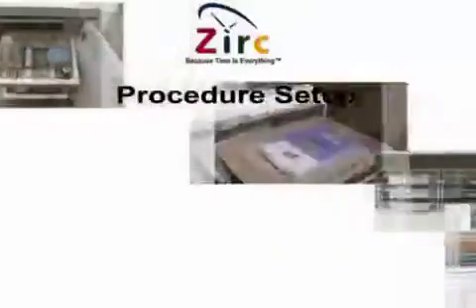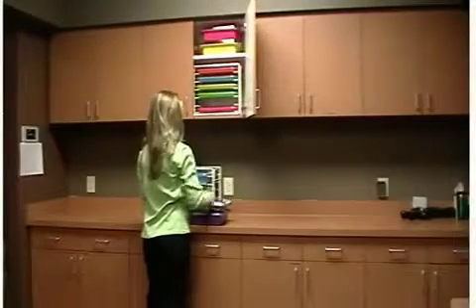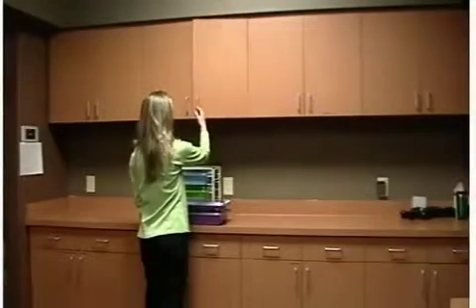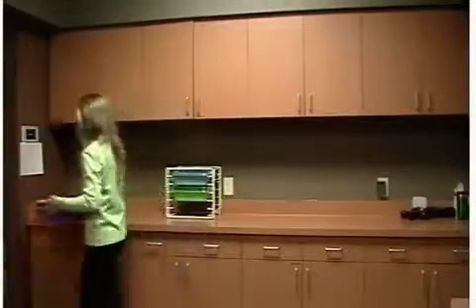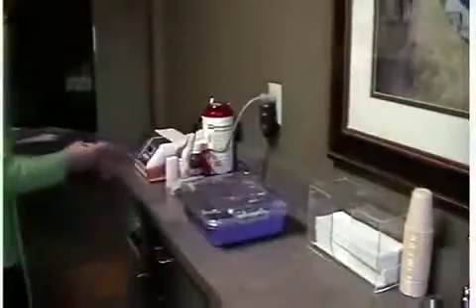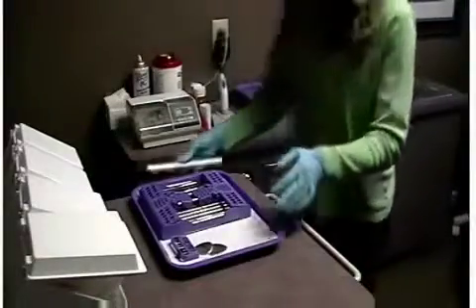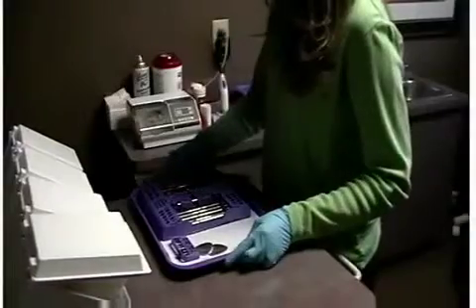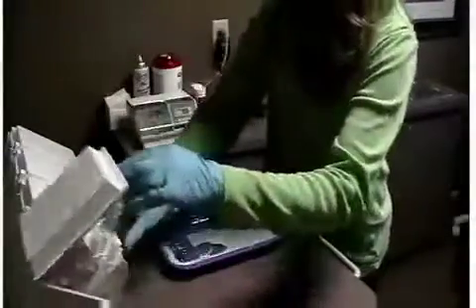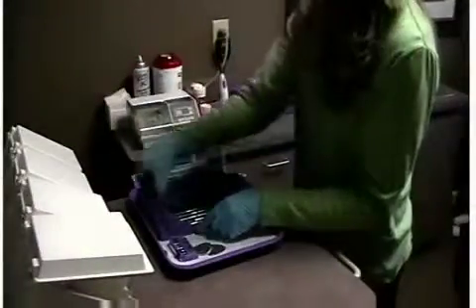Procedure Setup. When you are ready to set up an operatory for a procedure, simply pull the appropriate color-coded tray and tub. Your procedure tray will already contain all the instrumentation for that procedure, and your tub will have all the procedure-related materials needed. Zerk considers the tub and tray to be like the dentist's toolbox because it contains all your procedural items in an organized container that you can easily carry to the operatory without worrying about any items being left behind.